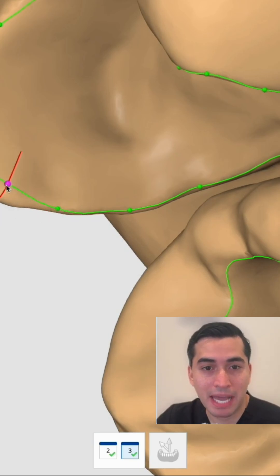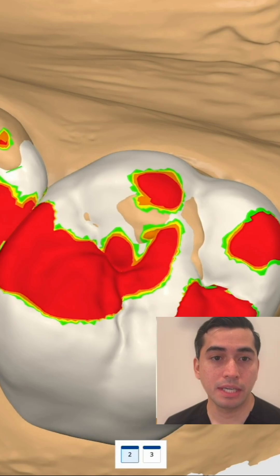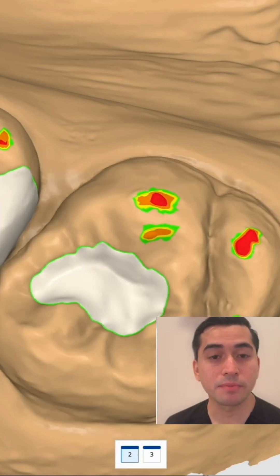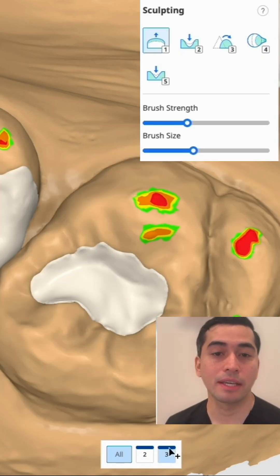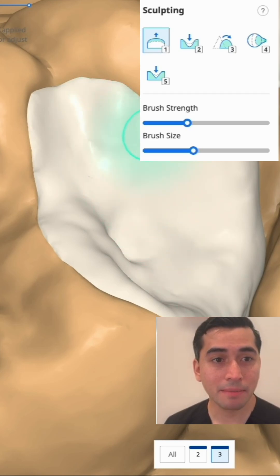Here's where it can get pretty artistic. You can use the add, subtract, and smooth tools — basically what I'm cycling through — to get this really nice anatomy.